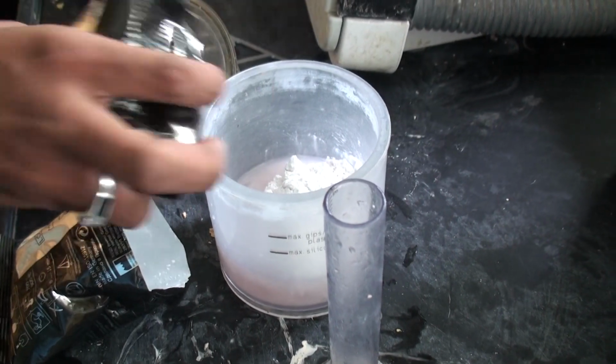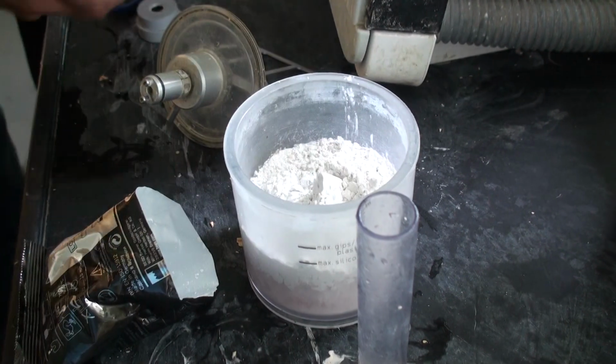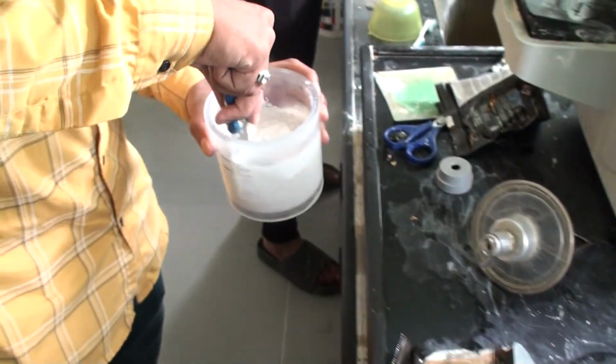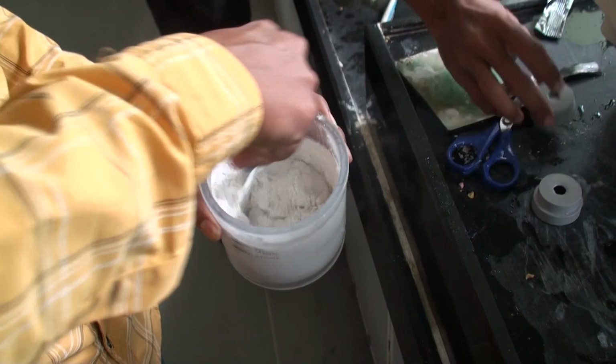So you put one measure, he's going to put another measure in it. So again, it's a lot about precise measuring, correct water and powder ratio.